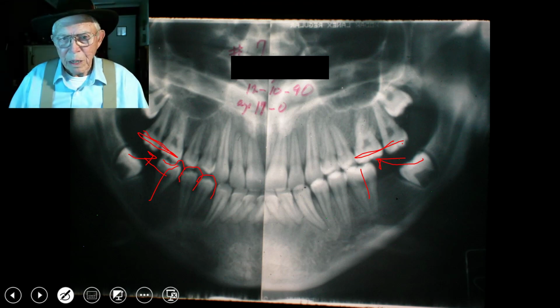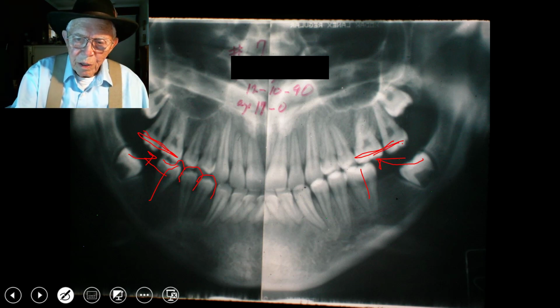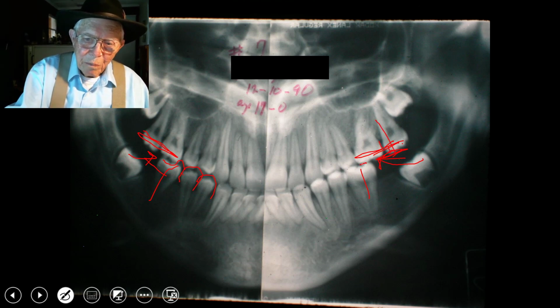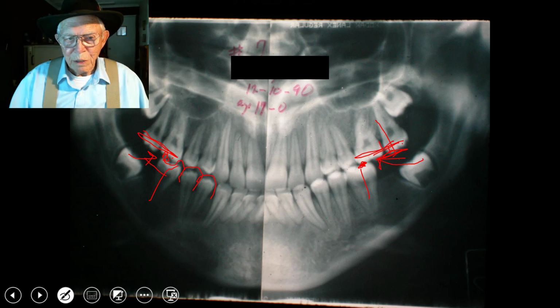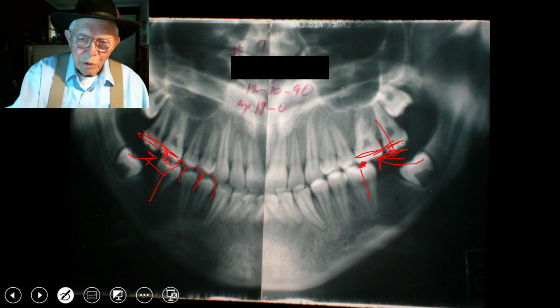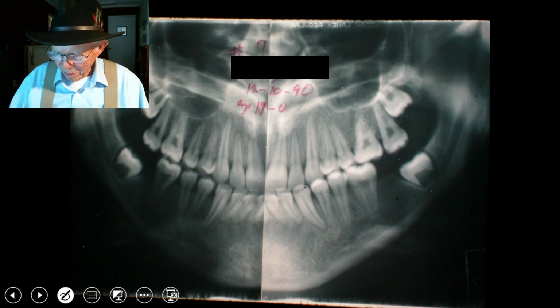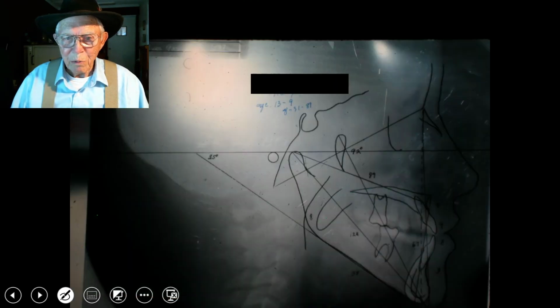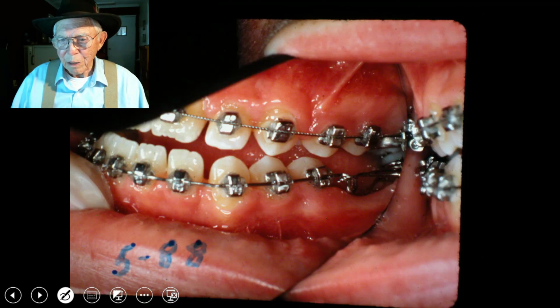And this is a complicated method of doing this and takes some time. This young lady's 17 years old now, and we're wearing a retainer that fits up here and doesn't let this drop down because it holds it here, and this contact point right there is the thing that keeps it up there, and that wisdom tooth will come on in that direction. You'll have to see that to believe it, I do think. But anyway, that's what happens in there, and that was the way it started correctly.